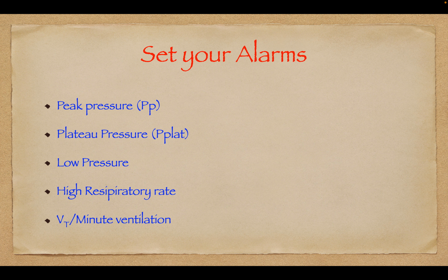How you need to set your alarms: of course, the peak pressure alarm, the plateau pressure alarm, low pressure alarm, high respiratory rate alarm, and the tidal volume or minute ventilation alarm. So these are very important alarms which we need to set.